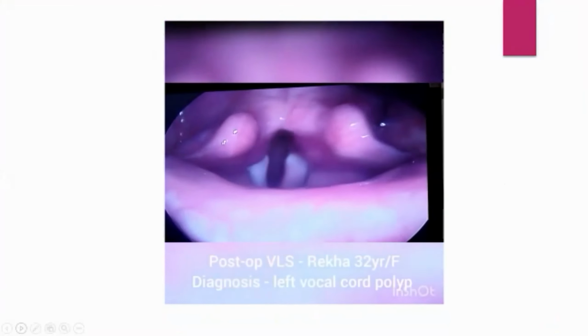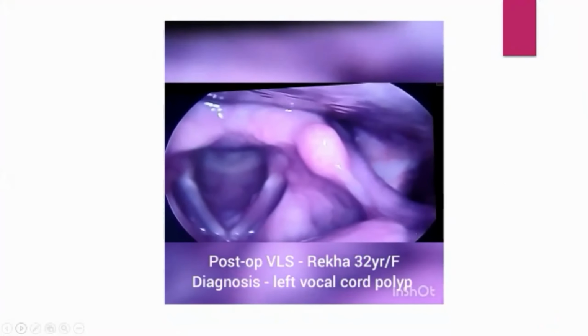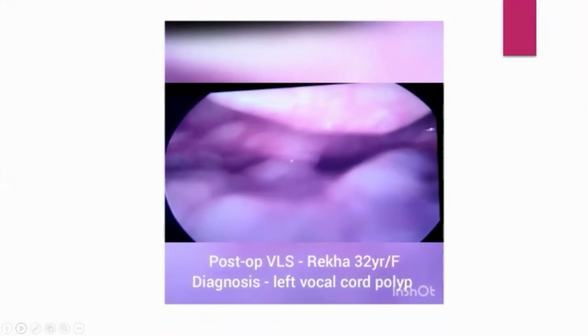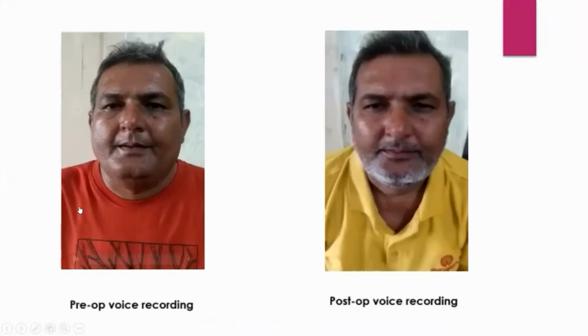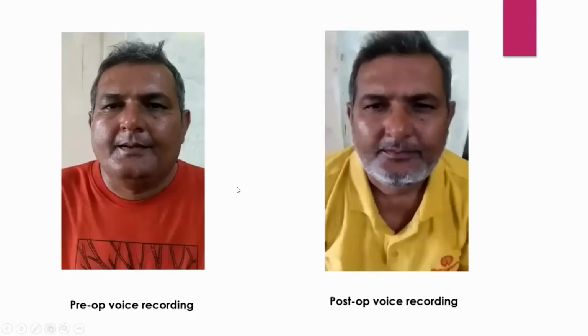This is the video stroboscopy. And after undergoing the cold knife microlaryngeal surgery, this was the status of the left vocal cord. And the patient underwent vocal fold exercises, speech therapy, and vocal fold hygiene. Next slide.